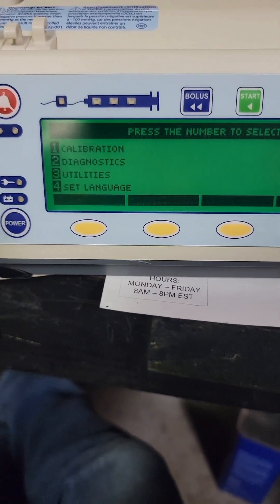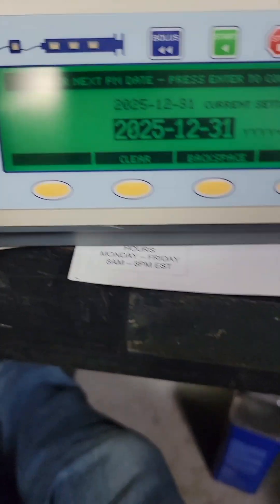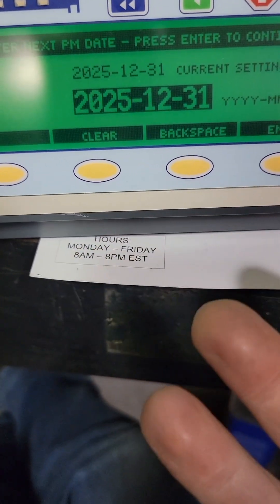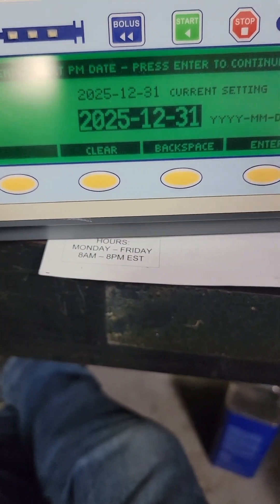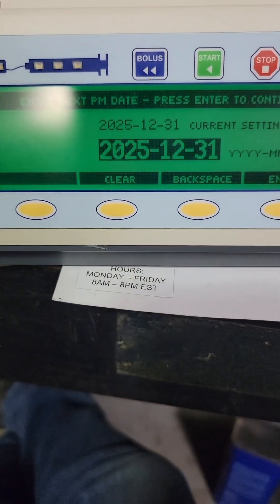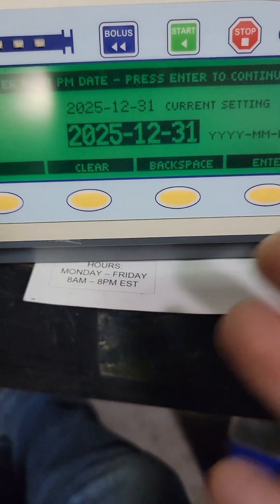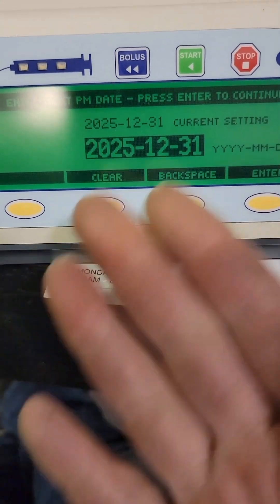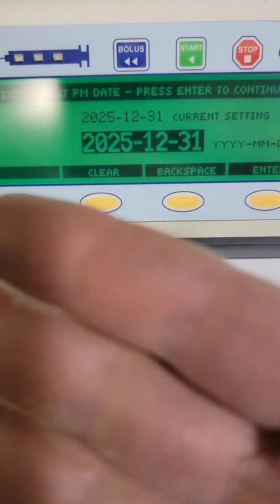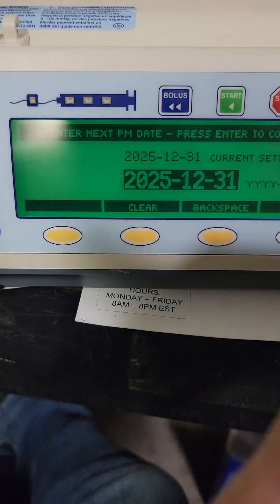One of the things you should remember to do — number three, utilities — set the next PM date. Make sure you reset this each time, otherwise you're going to PM it, it's going to go on the floor, and a nurse is going to be calling you that the machine is saying maintenance is due and it won't let her use it. Always adjust that for a year. This also helps you find it in a hospital setting since these things move all over the place — if you set it for the PM month it's due, it's going to find its way to you.